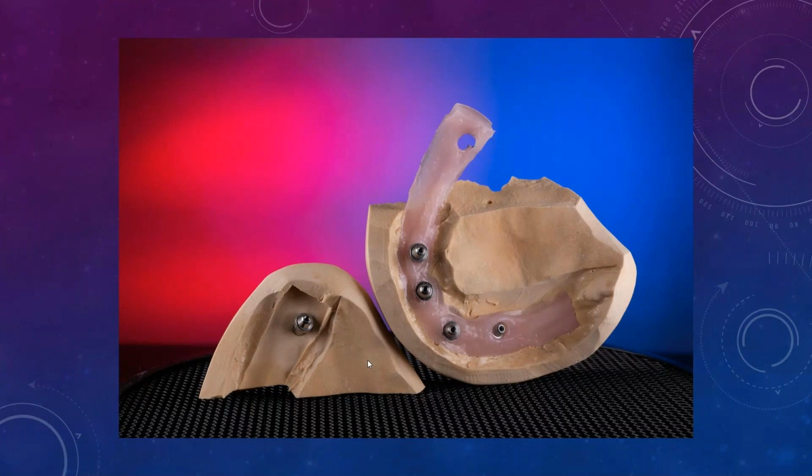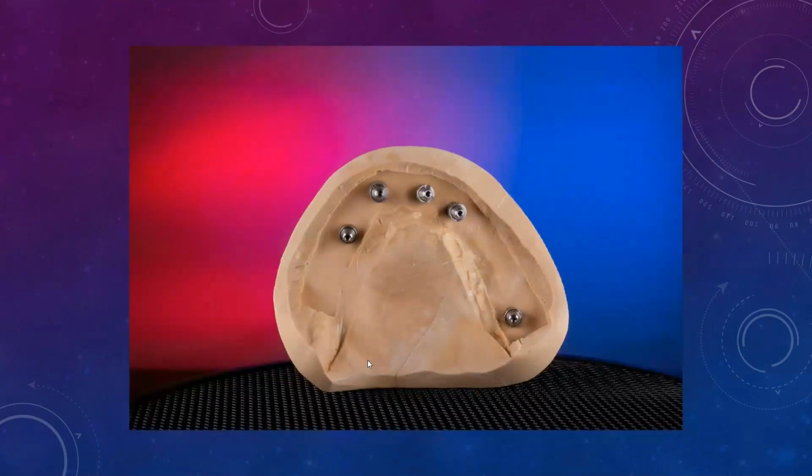So in this case, what I basically did is I glued the model first and put a new base on it, making sure everything's kind of nice and strong. And I know these 4 implants are passive, and I know this one isn't. So I need to realign this implant to these 4 implants. And this is how I will basically do it.